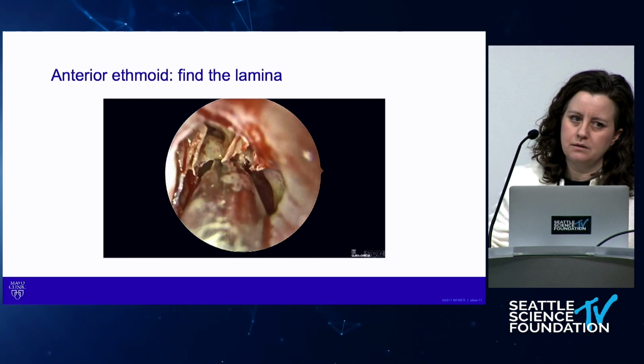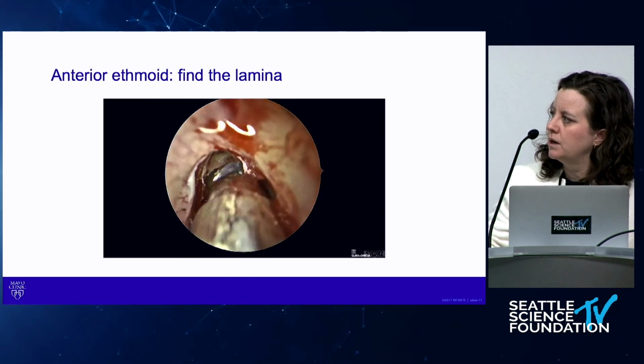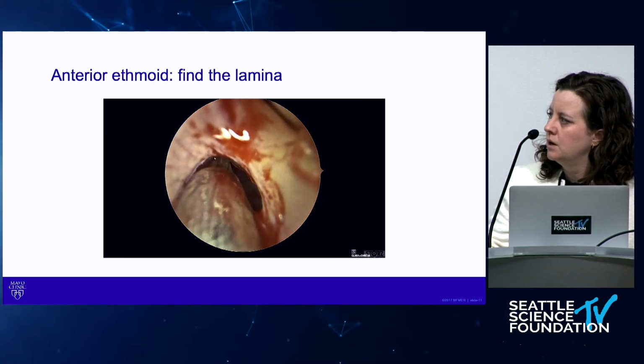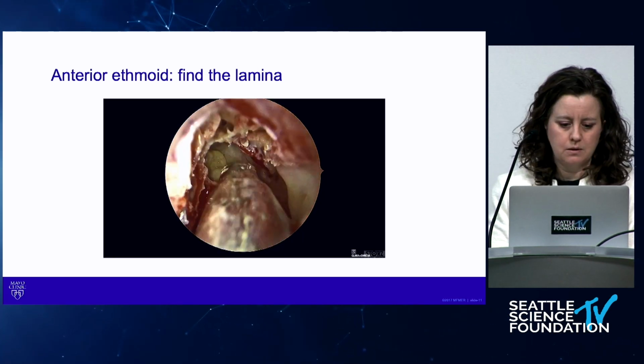I'm going to clean that skull base off completely later though, because I'm working on the skull base posterior to anterior, but I'm getting it cleaned up enough so that I have a big wide view here. Middle turbinate, lamina, maxillary sinus, basal lamella.